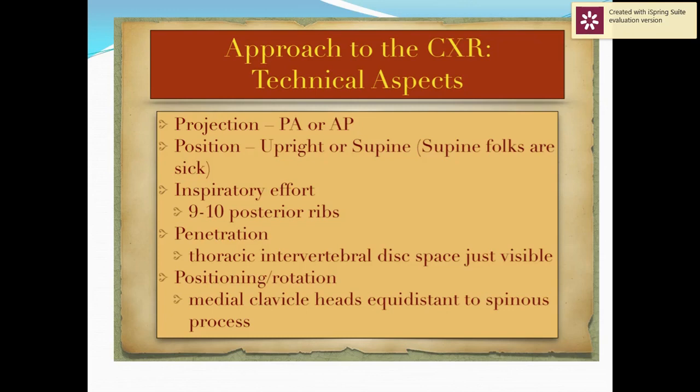Usually the patient اللي هو standard احنا we prefer as a pulmonologist a PA view, posterior anterior view is very important for us rather than AP view. The AP view usually done for the patient bed bound, patient in ICU is not mobile, وبالتالي we need to do for them AP view. لكن احنا بنفضل اللي هو PA view. Position it is either upright or supine.